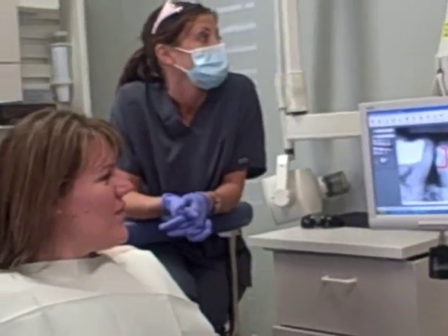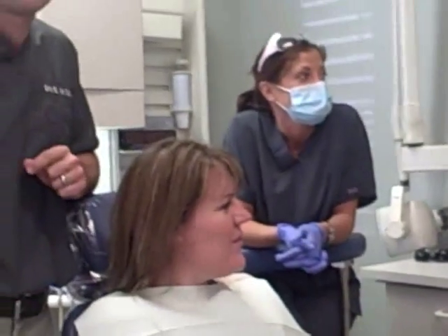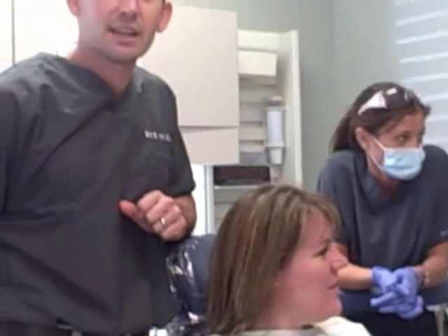From here, this is the perfect candidate for our CEREC CAD-CAM technology. So we'll get started with cleaning up the patient, cleaning up the tooth, and restoring the tooth using our computer system.